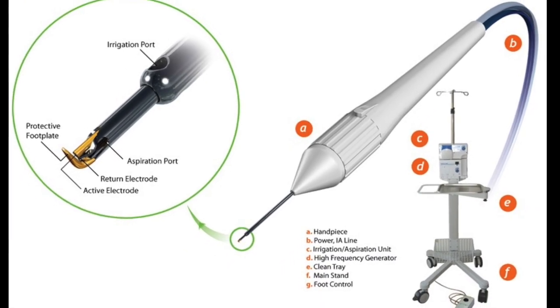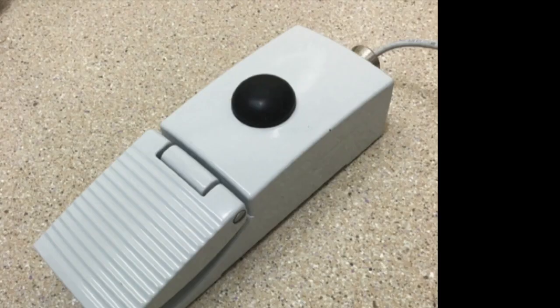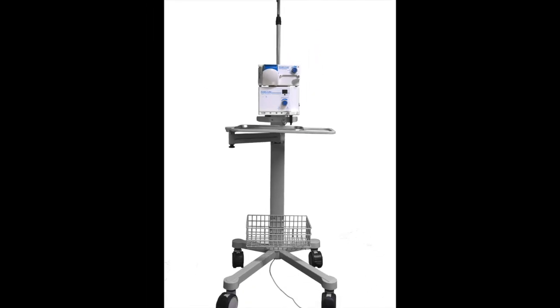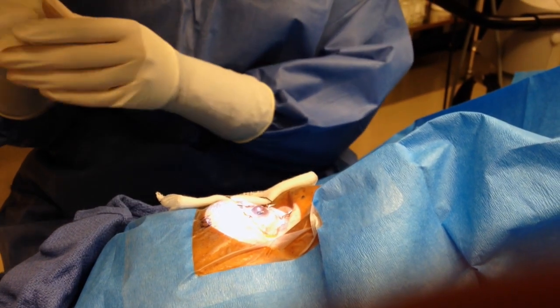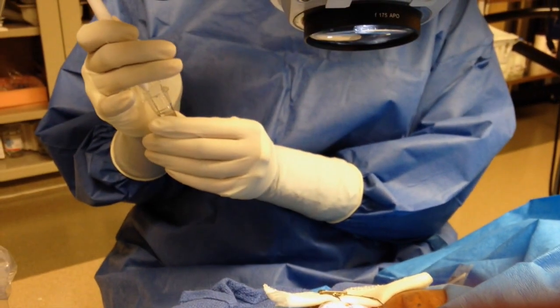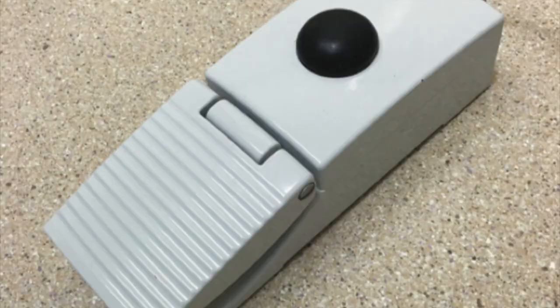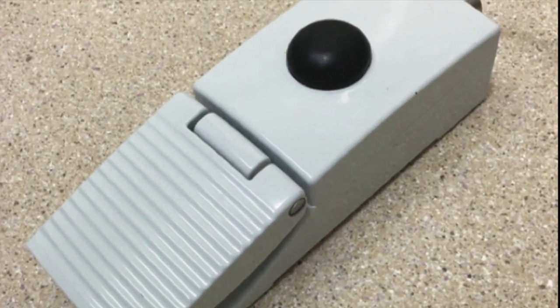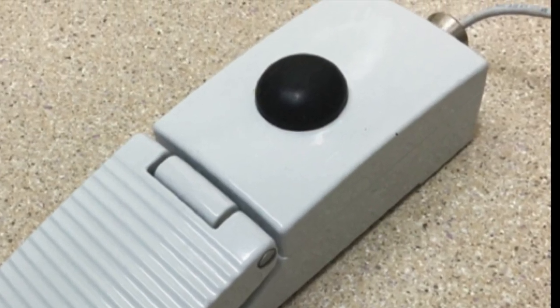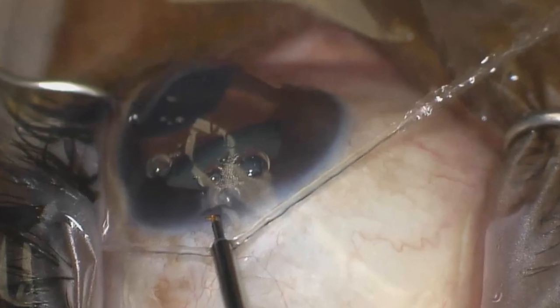The Trabectome system consists of the handpiece, the foot pedal, and the electrical fluidic base system. The handpiece has a cap that is twisted off by the surgeon — be careful not to damage the handpiece tip. Next, the black ball on the foot pedal, which should be set up in a comfortable position for easy access, should be depressed to activate continuous irrigation.